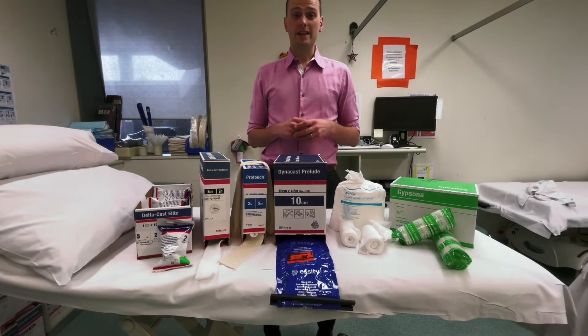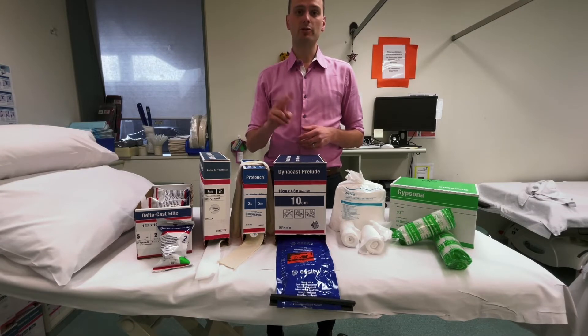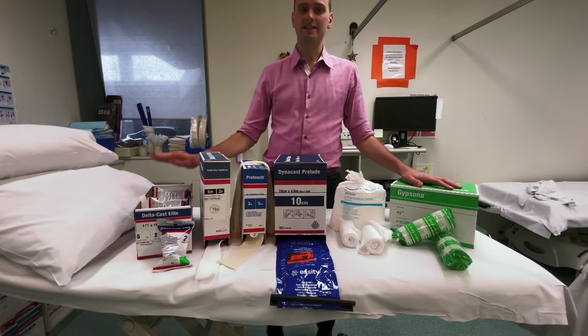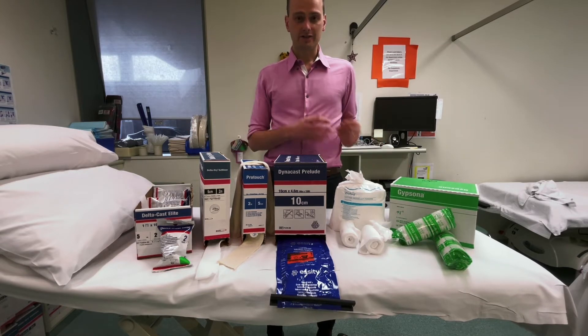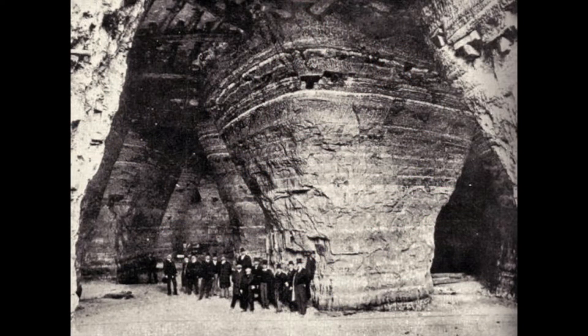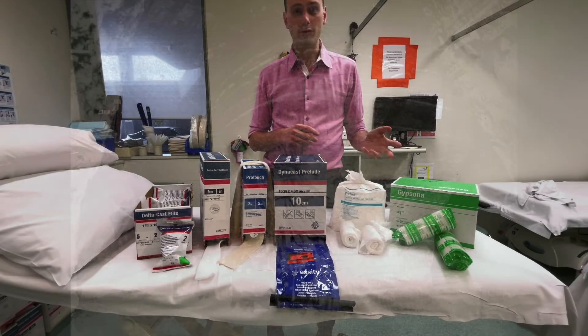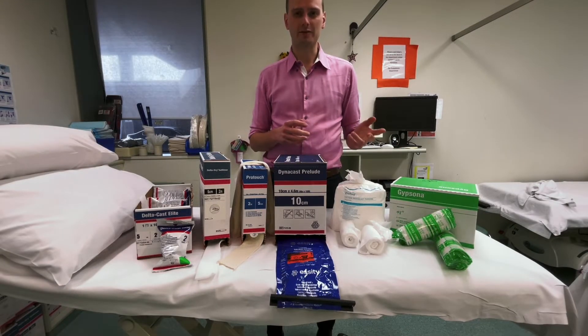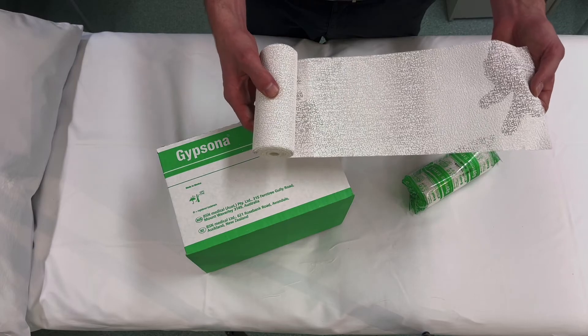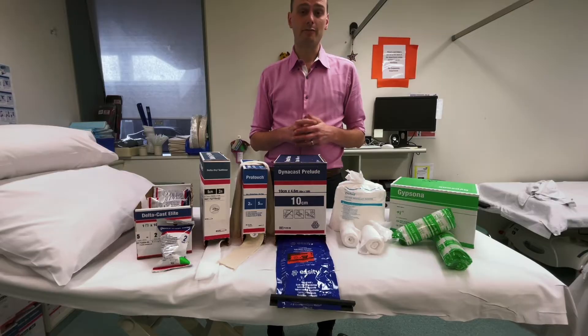When we come to the actual plastering and casting, there are two typical materials: plaster of Paris and synthetic. Plaster of Paris is named after the gypsum mines that existed underneath Paris, though a lot of it now comes from Mexico. It's the white plaster material you often see on casts that kids can draw on, and it's used for back slabs as well.